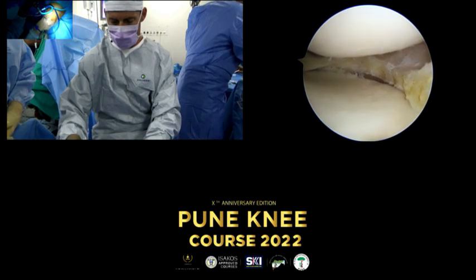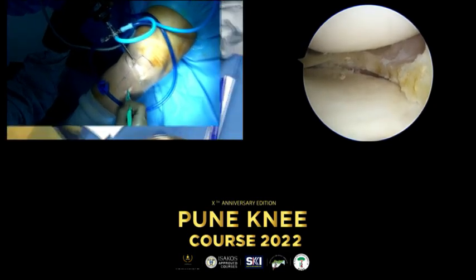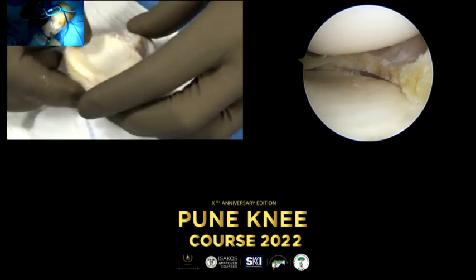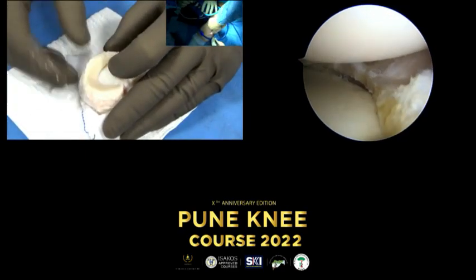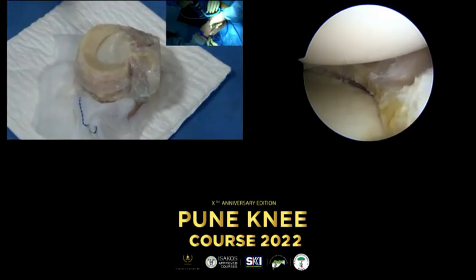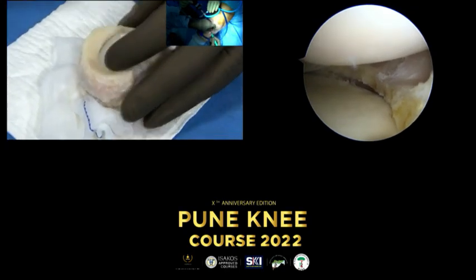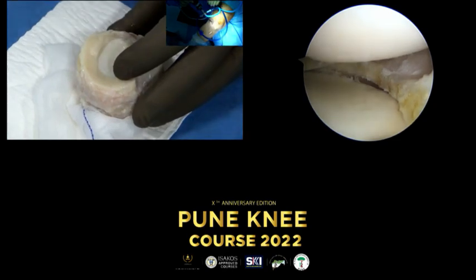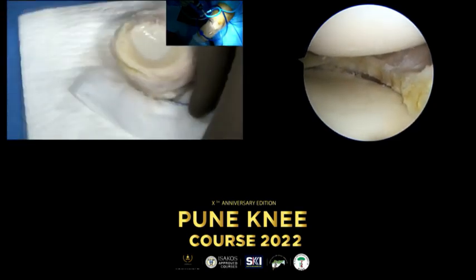There is quite a lot of soft tissue here, so I'm trying to make it a little bit bigger. Can you hold the scope? Pick up for me. We are just playing back the graft that you had. Ah, okay, I see, perfect. You could see it on the TV. Yes, I will describe it.